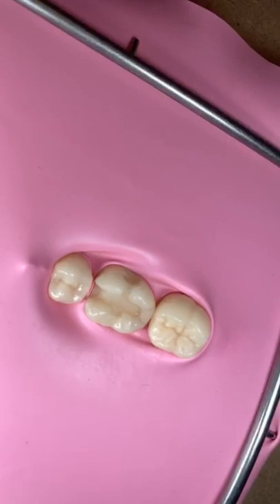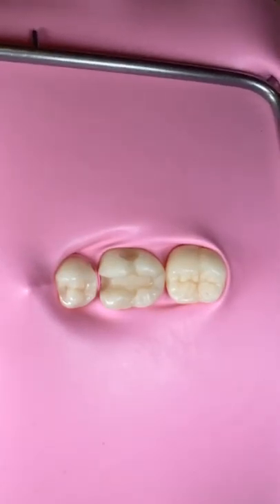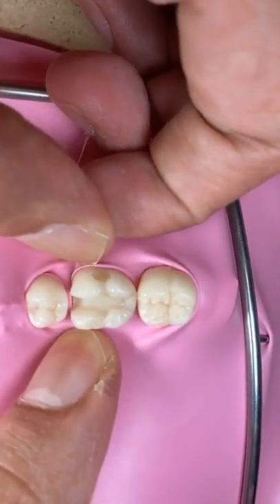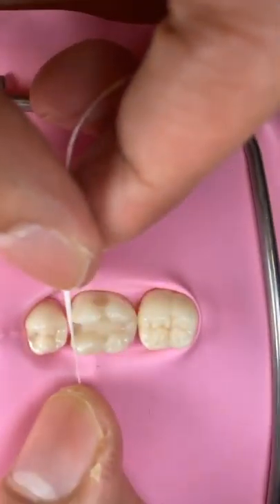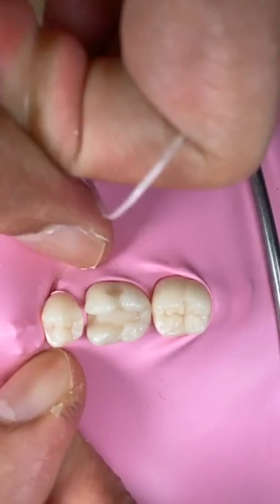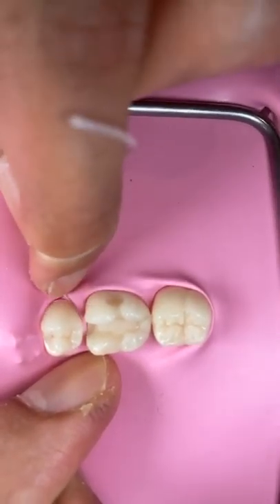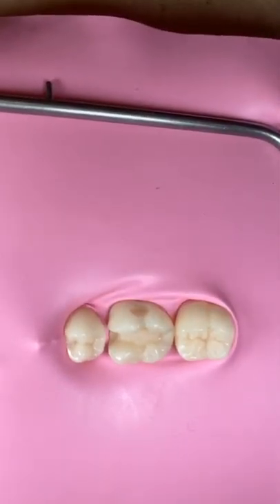Now time for the flossing, yeah. The inversion. Inversion is very mandatory, since there will still be leakage because of improper placement of the rubber dam. Yeah, you need to invert, you need to flip all the rubber dam to the cervical. Yeah, you make sure that you do that slowly, unless you do local anesthesia, because sometimes it's a bit uncomfortable for the patient.